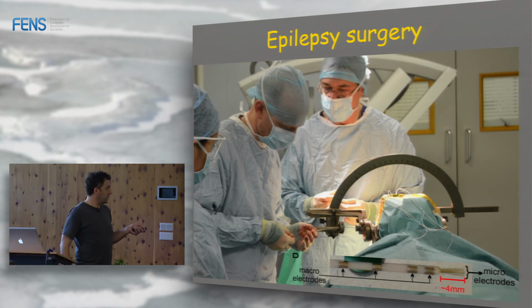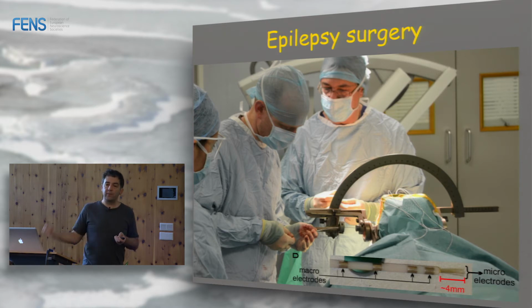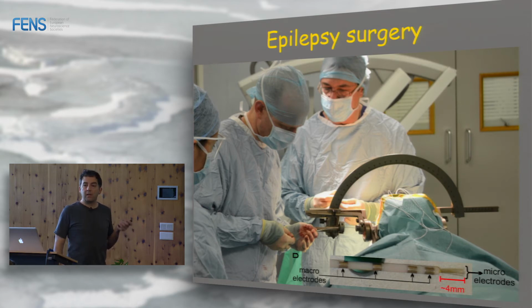So these electrodes, the ones we use, were developed in California by Itzhak Fried at UCLA. They have microwires at the end, and from these we can record single cells. Now, I say it now, I will repeat it later. The reason why human subjects have electrodes inside the brain is clinical, because the surgeons will put the electrodes there to try to cure them from epilepsy. But this gives us an amazing opportunity to record single neurons in humans, and that's what we do.